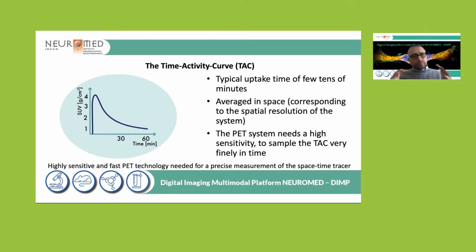With positron emission tomography, we can check the tracer perfusion or binding to a specific molecular or functional mechanism, and we can look at it in time. We can produce a time signal out of that, which we will call the time activity curve. It is how the activity in the specific region we are looking at is changing with time.